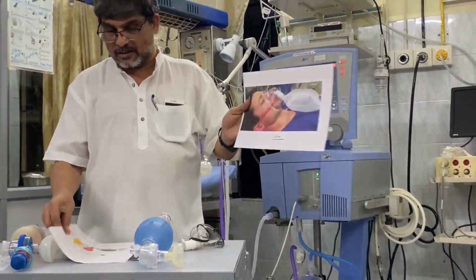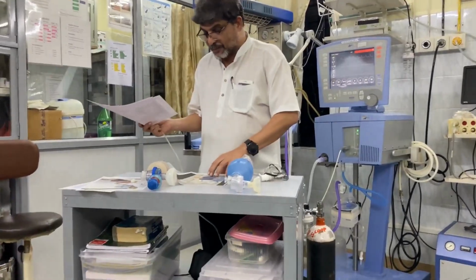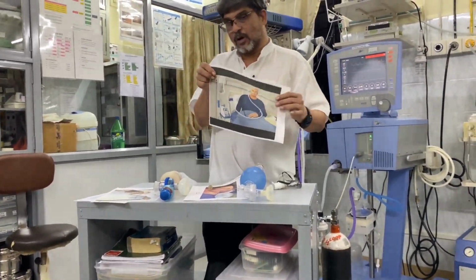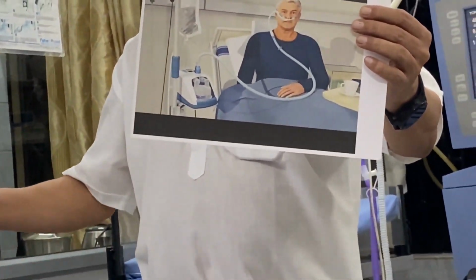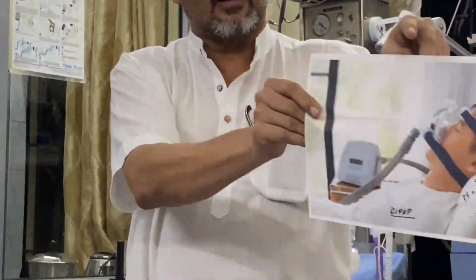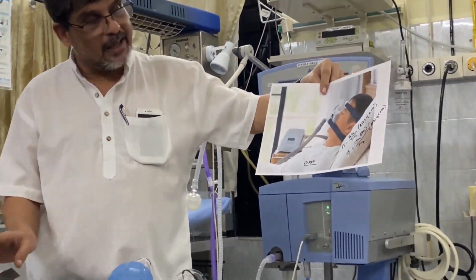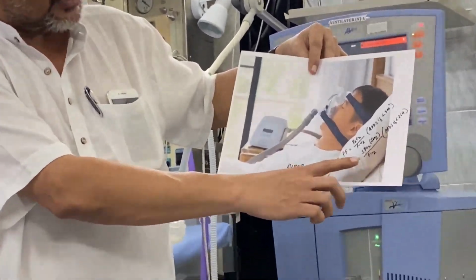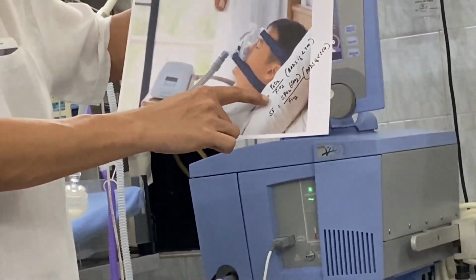Once this fails, so from free flowing mask you have gone to Venturi mask, then to the non-rebreathing mask, you have to resort either to something known as high flow nasal cannula oxygen or something known as BiPAP. And if this fails, then you use this formula, something known as PF ratio and SF ratio. PF is PaO2 and FiO2.